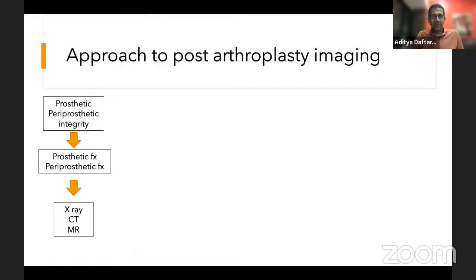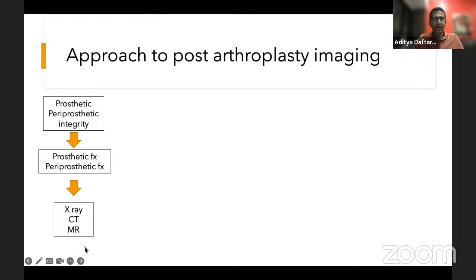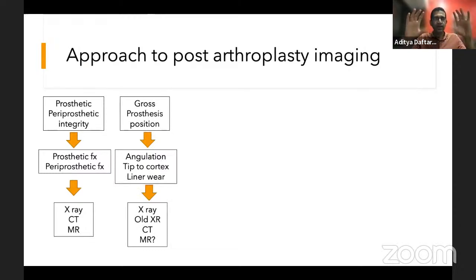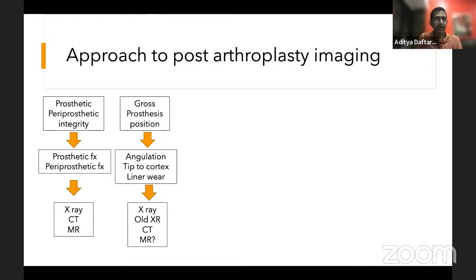So what is the approach to arthroplasty imaging? First, I look for prosthetic and periprosthetic integrity — fractures or breakages in the metal. X-ray and CT are probably most important here; MR is less useful. Next I look at gross prosthesis position: is it appropriately located, tilted, or off? If the tip is going to the cortex — that's abnormal angulation and concerning.